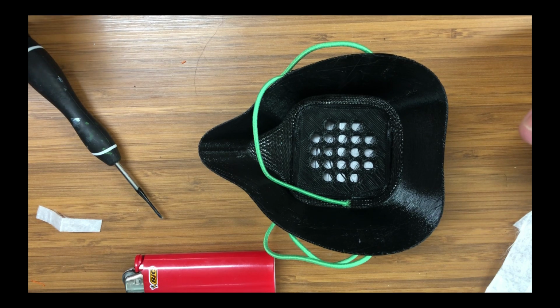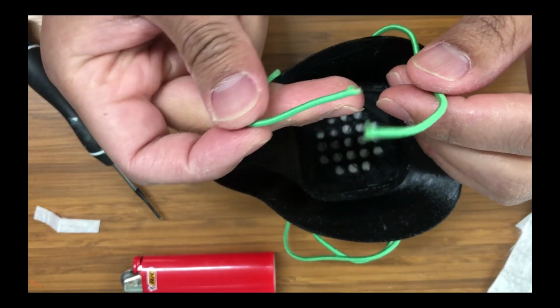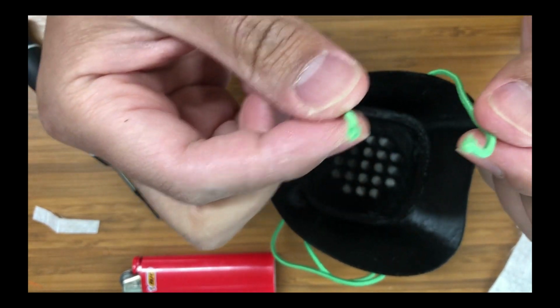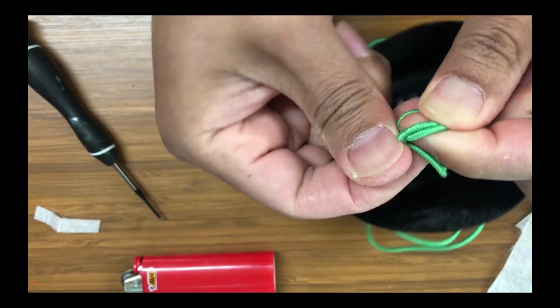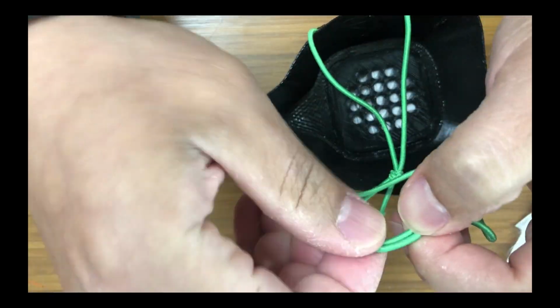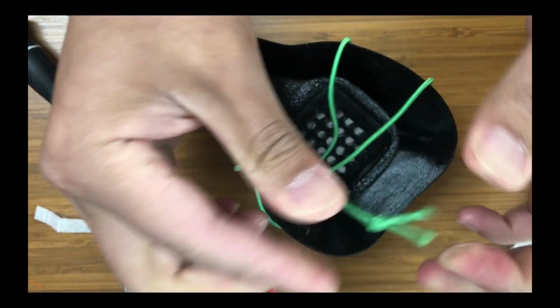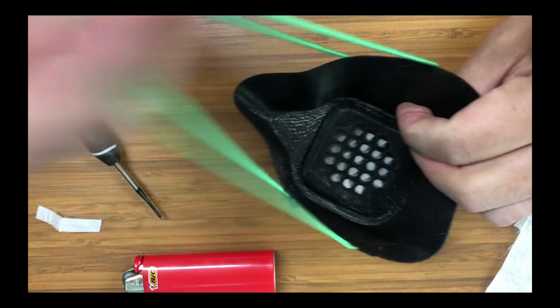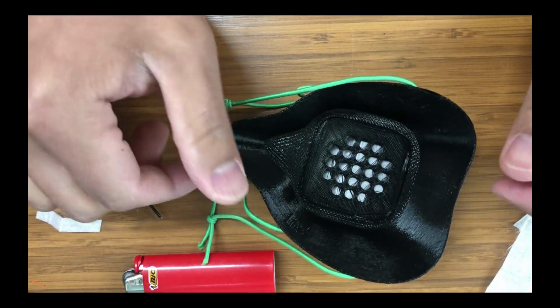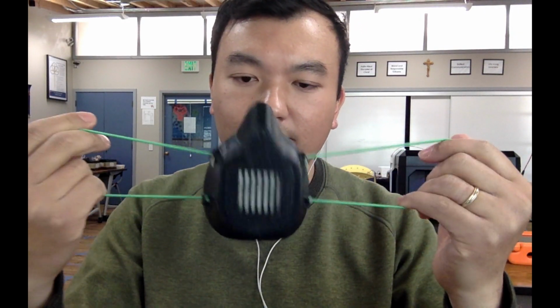Okay, so this is what it looks like. Now, obviously, I need to tie these bands right here. So we're going to do that. Okay, nice and stretchy. It's working out well, guys. So let me put this on to see what it looks like. So here we go. There you have it. I have a working face mask. Yay!